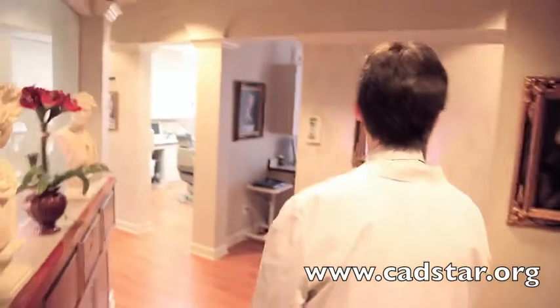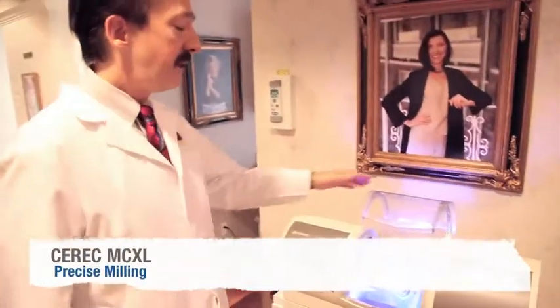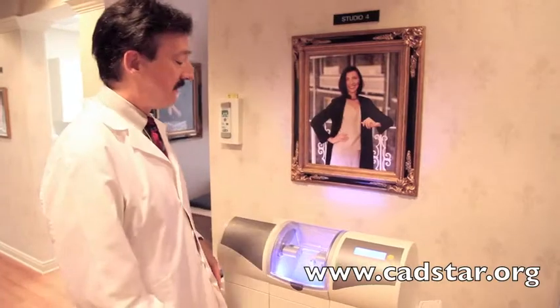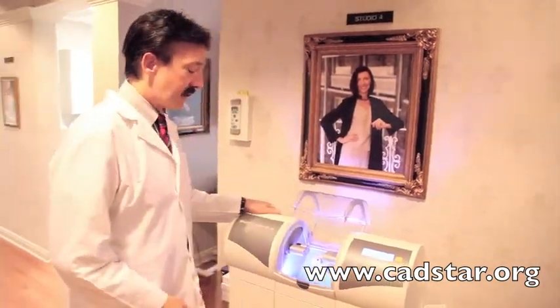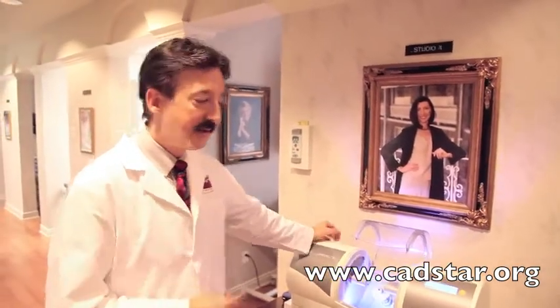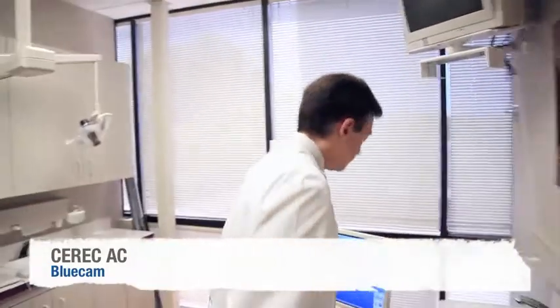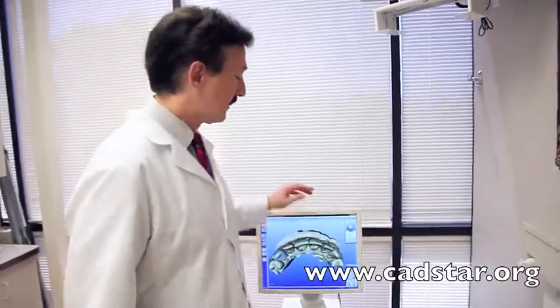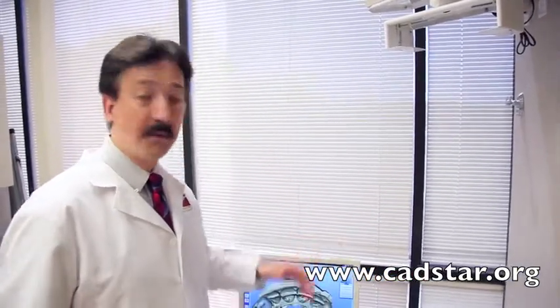This here is my CEREC MCXL milling unit. When this is going and patients are moving down our treatment hallway, they always ask questions — it has an inherent synergy of excitement and technology. This unit is very precise; you can get excellent mills with it. And this is my CEREC AC unit with the blue cam — a recent upgrade, particularly with the optics and the blue cam LED camera. It's really, really precise.